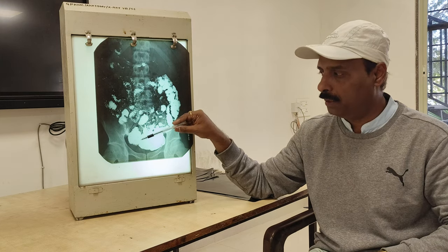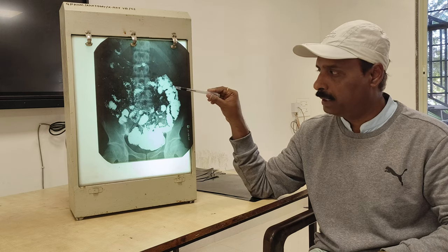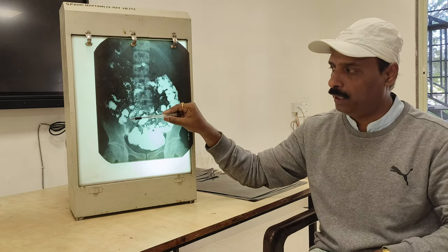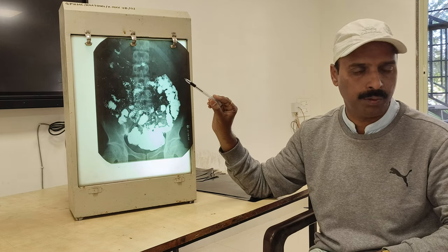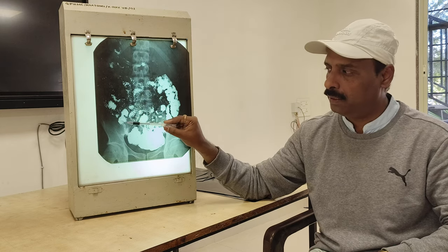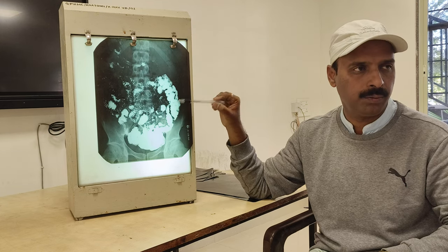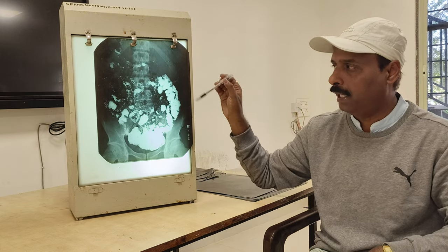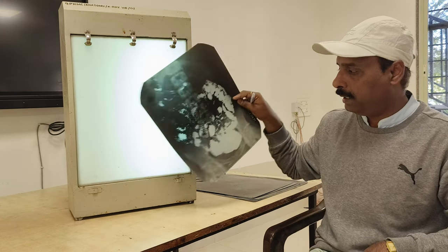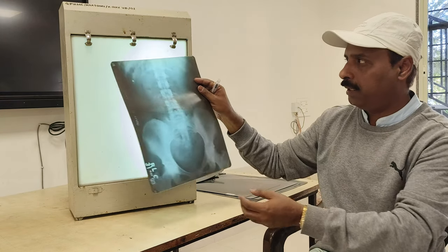Here we are going to see the rectum, then sigmoid colon, descending colon, transverse colon, ascending colon, up to the ileocecal junction. That is the distal part till the ileocecal junction, where the dye is there. So that is what you have to remember, and this we call a barium enema.